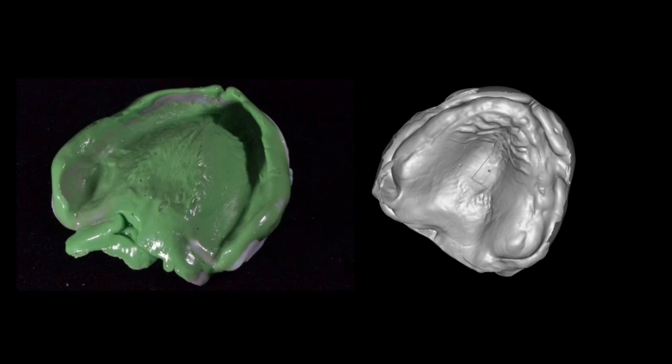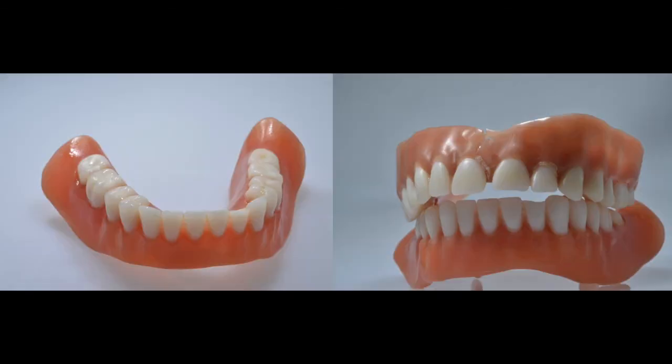So we discussed the outlines required for a good impression for the mandible and the maxilla. And please take a look at this picture again that I showed you at the beginning of this outline form. Now you should be able to see which outline forms are missing or incorrectly registered in this particular prosthesis.